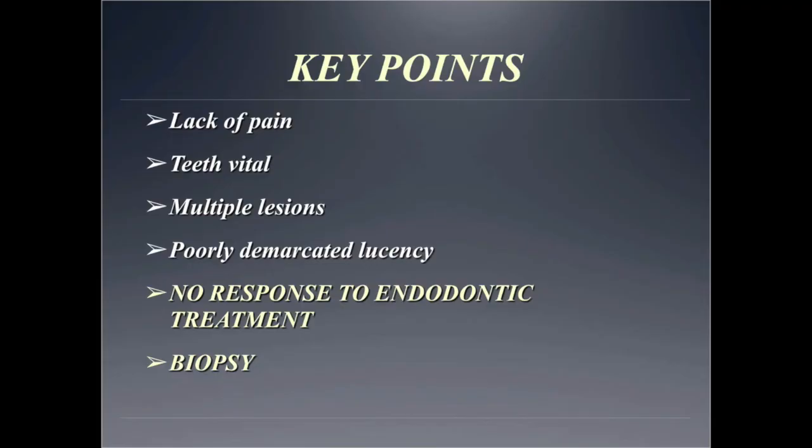So to recap, there is a lack of the pain you would expect associated with a tooth that's necrosing or that has died. The teeth are vital, and yet they're surrounded by lucencies. That's another key point to think of something else. Multiple lesions: look at the whole area, look at a panoramic radiograph, look at a CBCT, but take a look at the whole patient and get an idea of what is there in the oral cavity. That is very important.